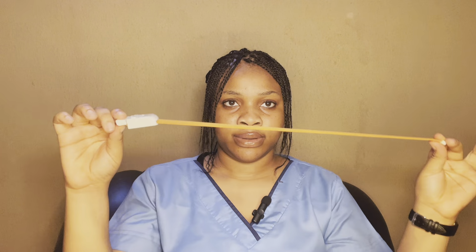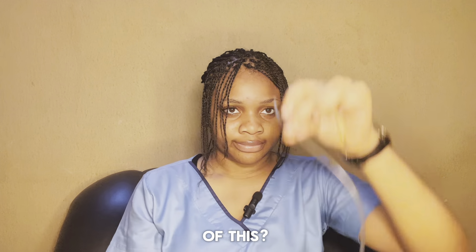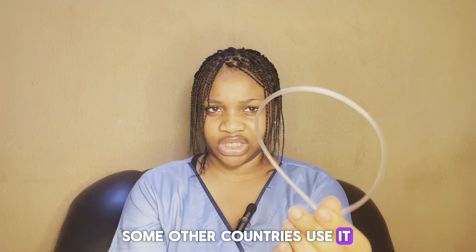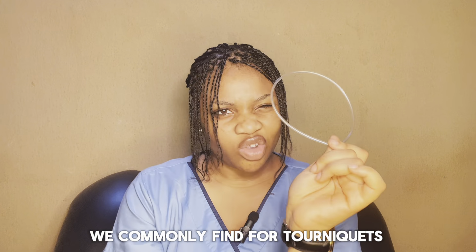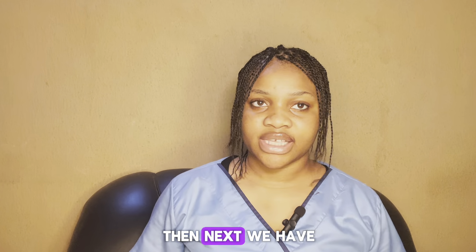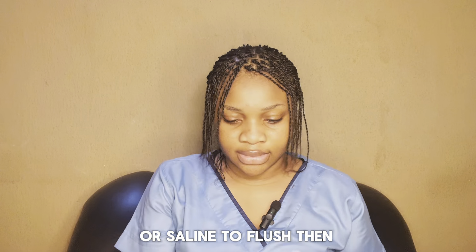We have the tourniquet. This is a tourniquet. But in my country, Nigeria, even though some hospitals have this, they don't make use of this. You know what they make use of? This. This is the Nigerian tourniquet. I don't know, maybe some other countries use it, but this is what we normally find for tourniquets in the hospital here. You know where they get this thing from? Let me show you. From this. This is where they get it from. This is our tourniquet.